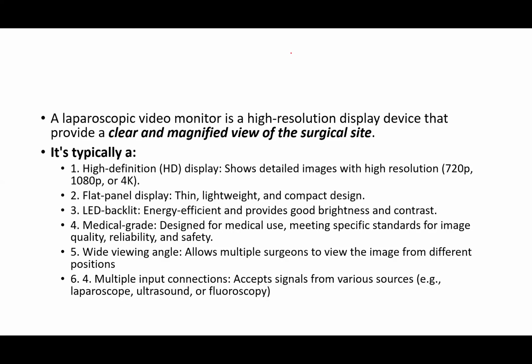It's a flat panel display, thin, lightweight, and compact in design. LED backlit, okay, energy efficient, and provides good brightness and contrast. It should be a medical grade device.